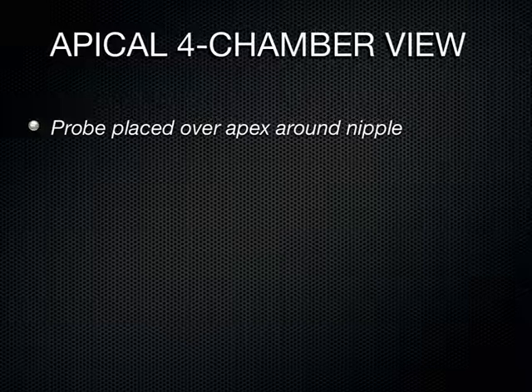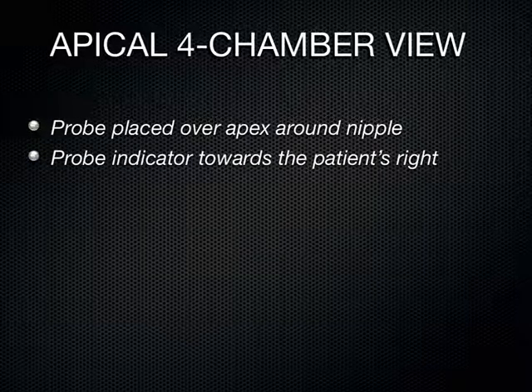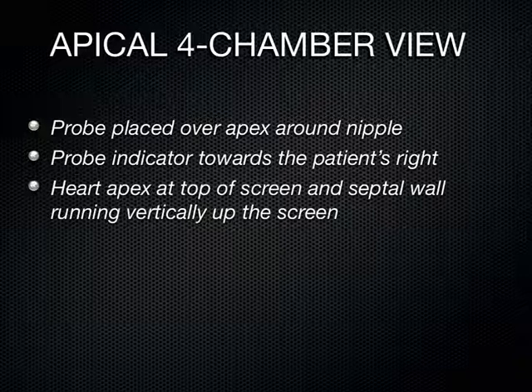So this is one you're going to struggle with to obtain, but it's the one that gives you the most bang for your buck. You're going to place that transducer just inferior to where the nipple line is and lateral in that area down there by the nipple. And you're going to have the indicator to the patient's right.